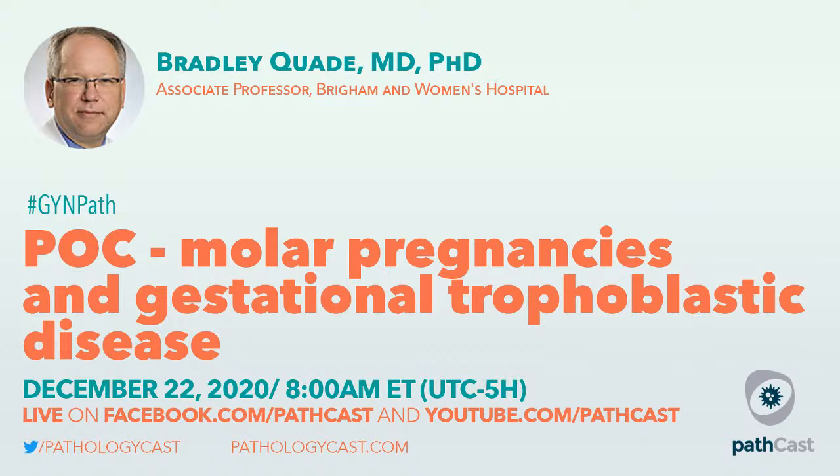What I most often see are patterns where there's a little bit of villus swelling and villus sclerosis, and it's much more of a mixed pattern. Especially with time, the pure hydropic enlargement is relatively uncommon. So much so that it's kind of hard to find really good pictures or good slides to refresh the teaching collections. It's much more of a mixed bag now. So I view it as more of a spectrum, with the hydropic abortus being at the far end of the spectrum.